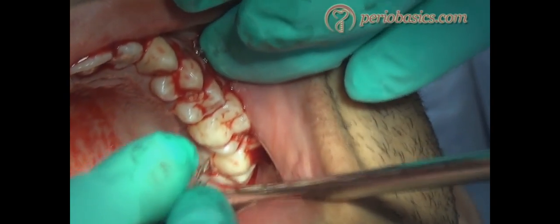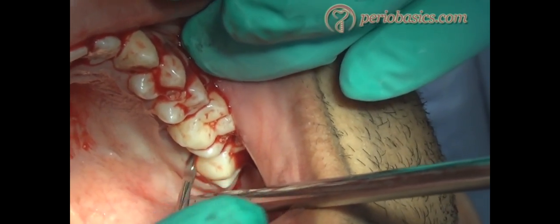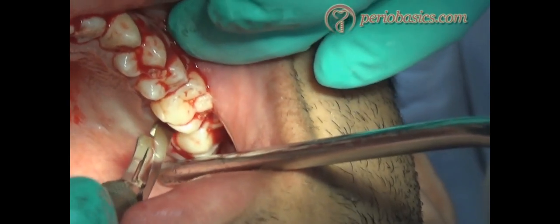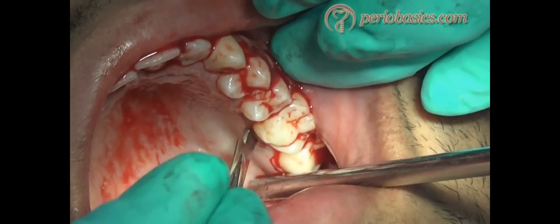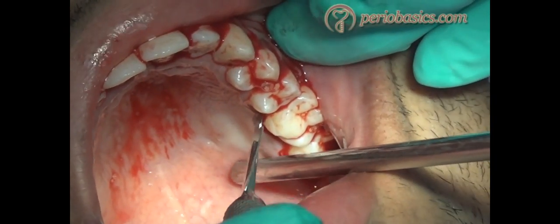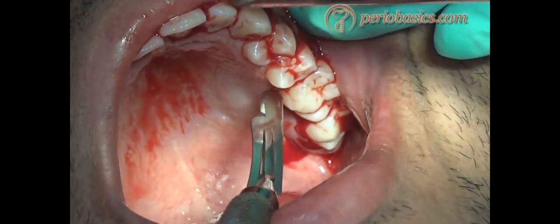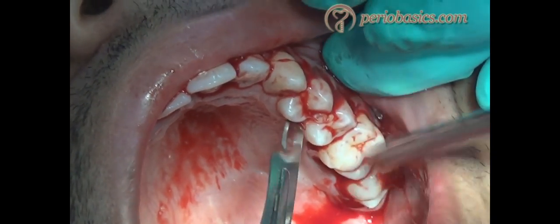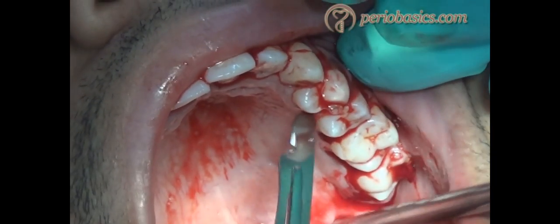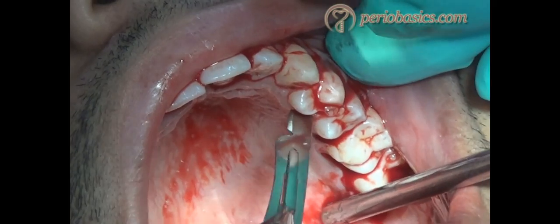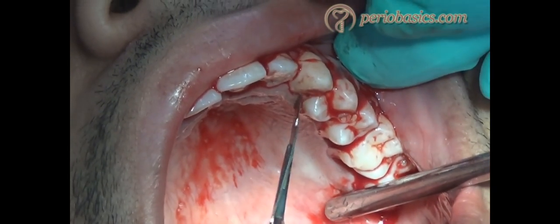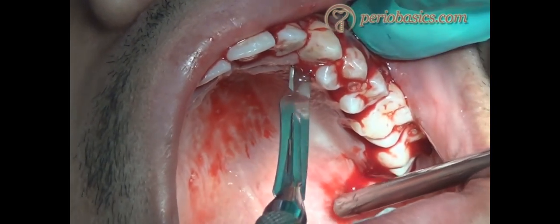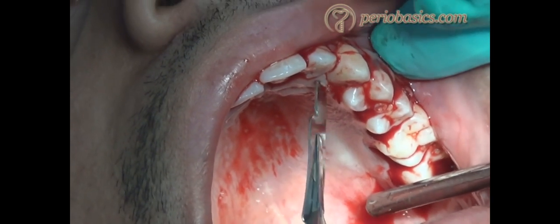The same incision is repeated on the palatal aspect. You can use a contra-angle BP handle because in the molar areas it is difficult to put the internal bevel incision with a straight BP handle. This is how we complete the incision. Thank you very much for watching.